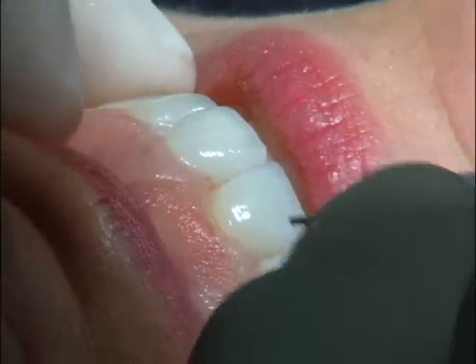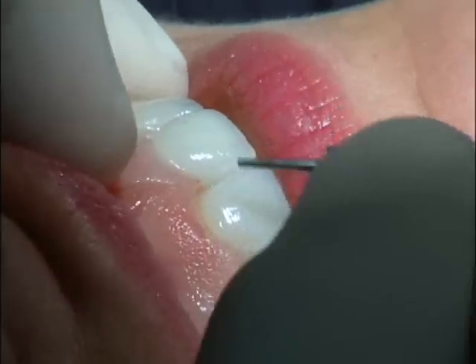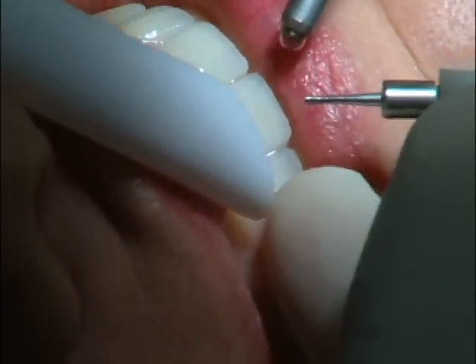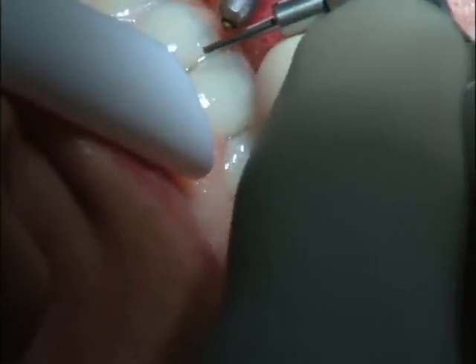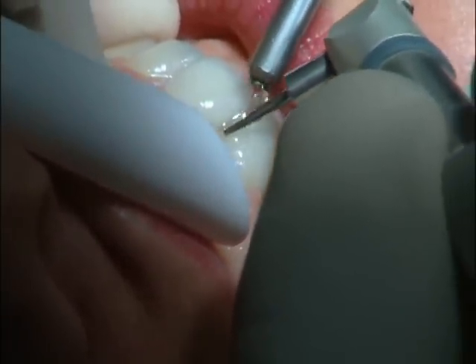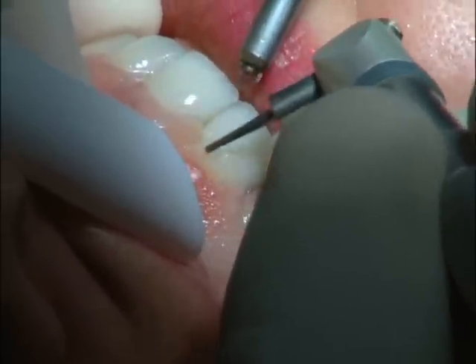So now, at this point, my gingival contour is equal to or a little higher than the one on the implant. So I'm just going to go in now and lightly just touch up the edges. Just barely drawing it — just a paintbrush effect. Contouring.